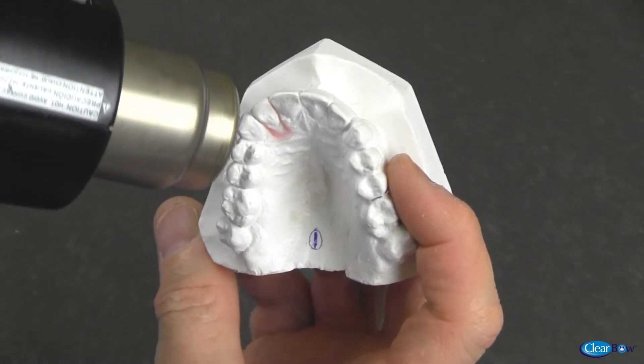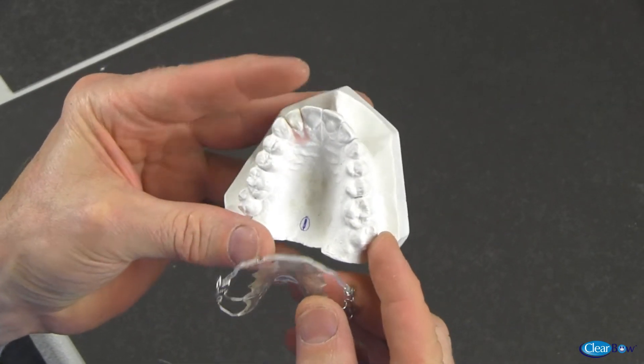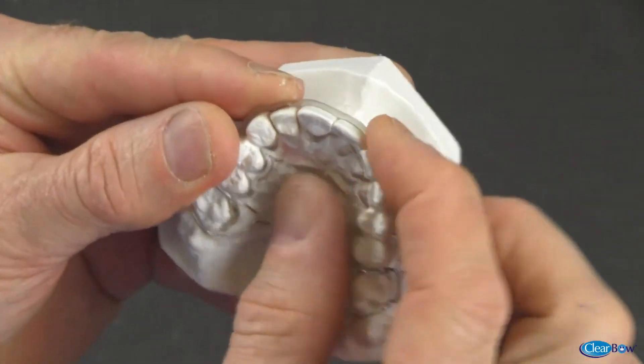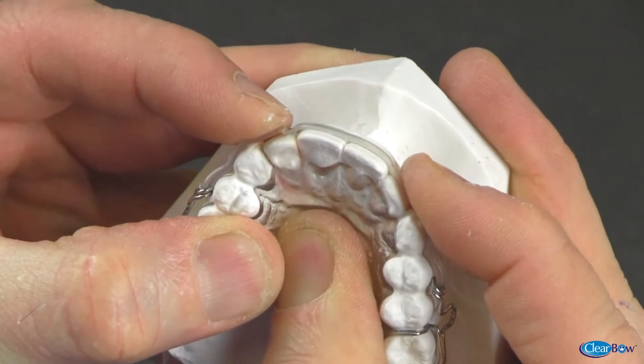Heat is applied on model number one to soften the wax. The retainer with the adjusted clear bow is placed on this model. The clear bow will apply pressure to the lateral tooth, simulating actual tooth movement.